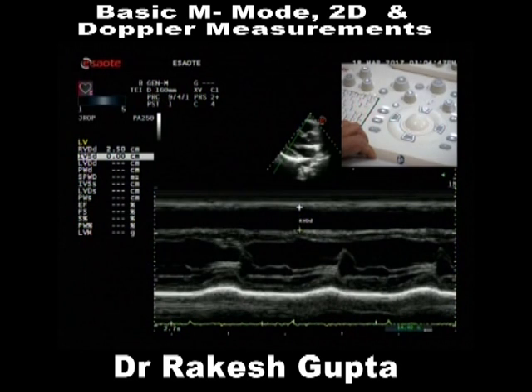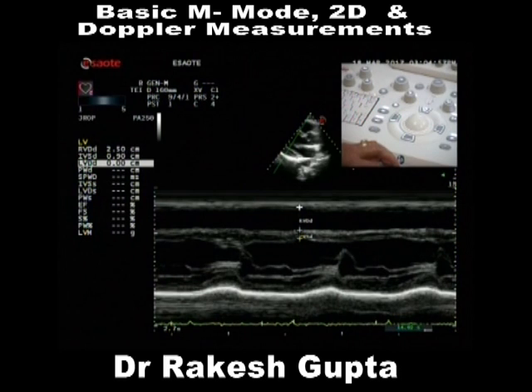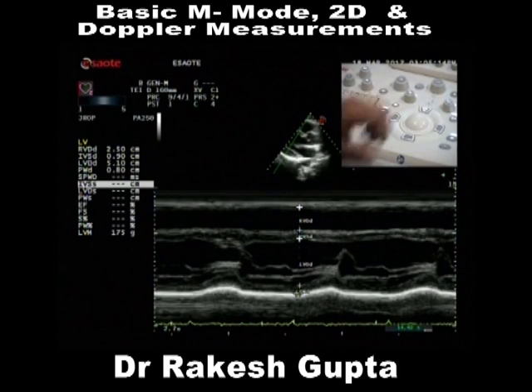Now it is asking what is IVS during diastole. So this is IVS during diastole. I said enter. It is in continuation. Now LV dimension during diastole. Now this is 51. Enter. Now it is asking posterior wall diastolic dimensions. So this is posterior wall diastolic dimensions.